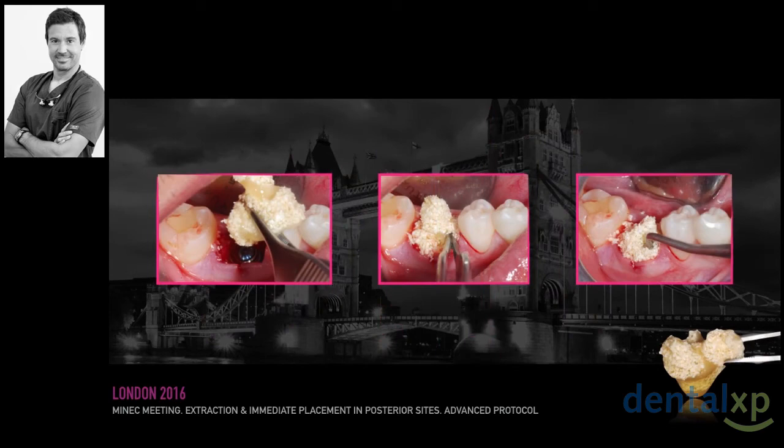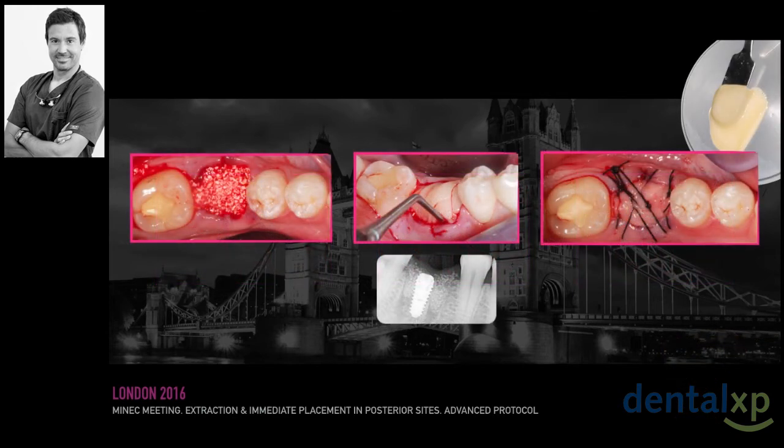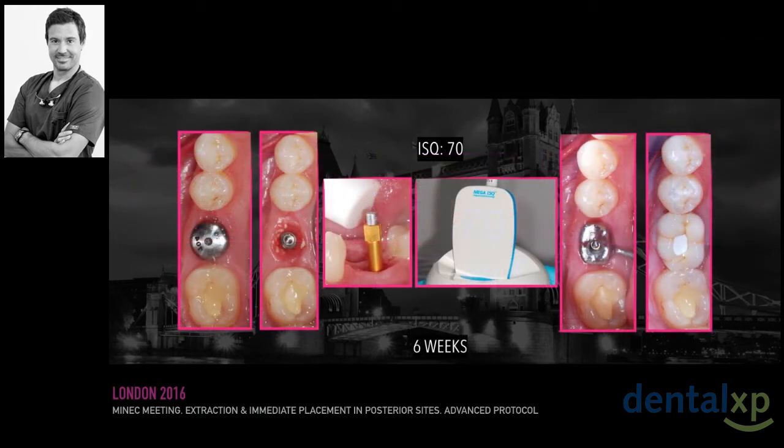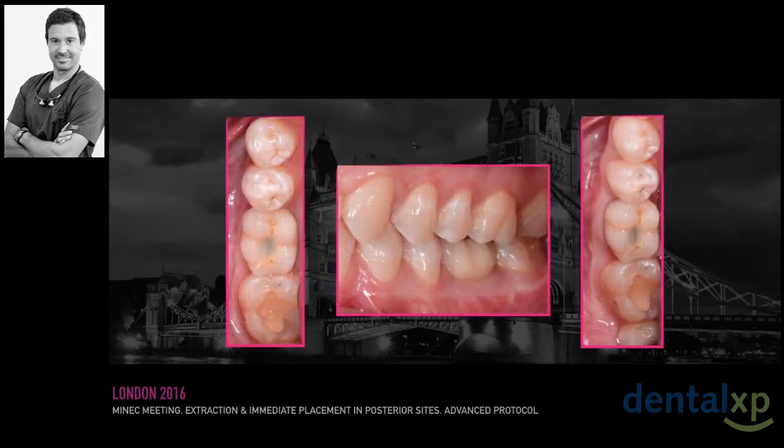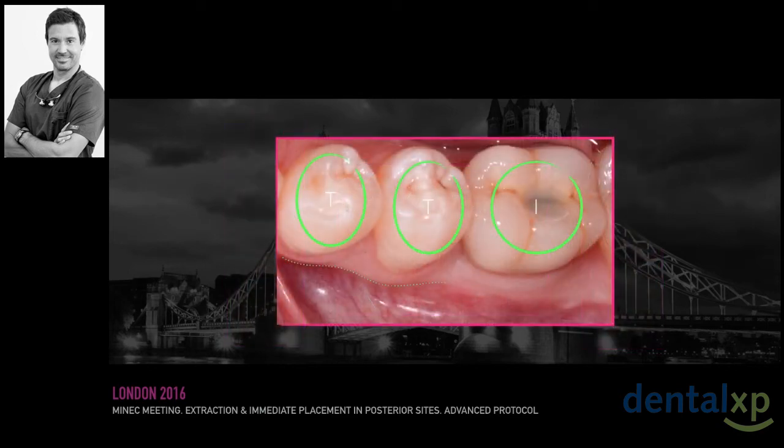Fraction 2 of PRGF mixed with synthetic bone, beta-tricalcium phosphate in this case, is packed into the sockets, as well as fraction 1, which we use to create autogenous membranes, placed on top of it in order to compact the bone and avoid particle loss. Crisscross sutures are used, and after 6 weeks of osseointegration, ISQ values are confirmed as well as soft tissue health. Here you can see the sequence of our protocol and the final result. What I like from this last picture is how we preserved the bone architecture compared to the adjacent teeth. At the end, we did not change the soft and hard tissue contour.